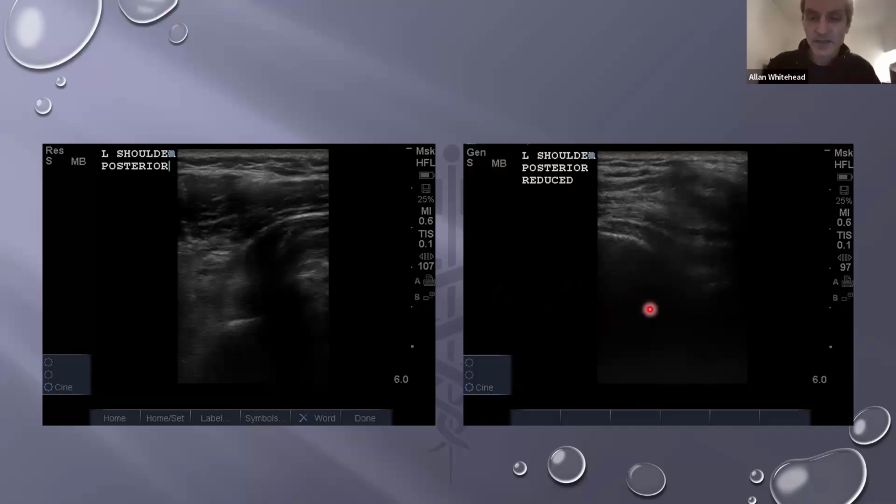Once we've done the reduction, if we look at the right side of the PowerPoint presentation, the head has now moved in relation to the glenoid upwards, closer to the probe, because that's placed posteriorly. Now it's actually closer to the probe than the glenoid. That's probably the most common scenario. It doesn't frequently line up perfectly.